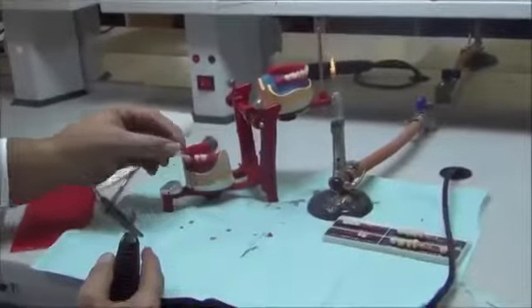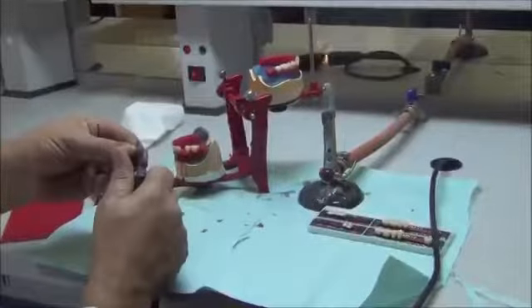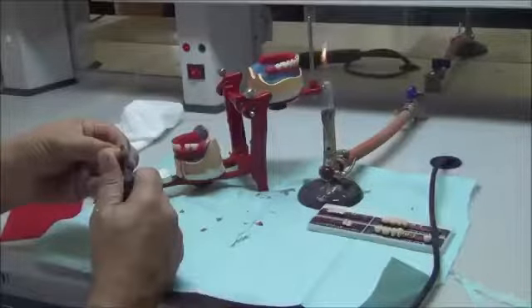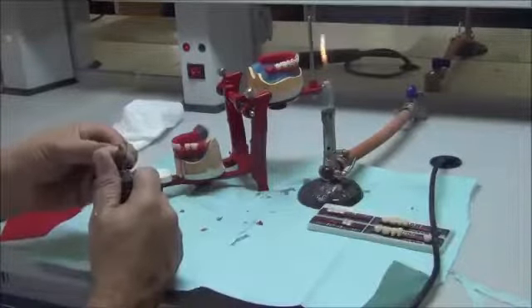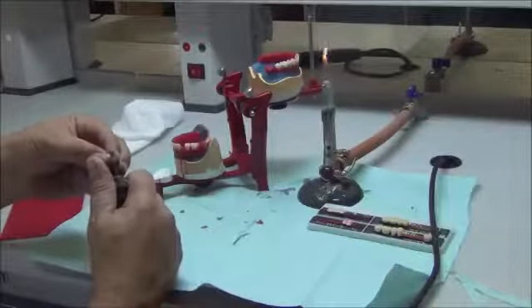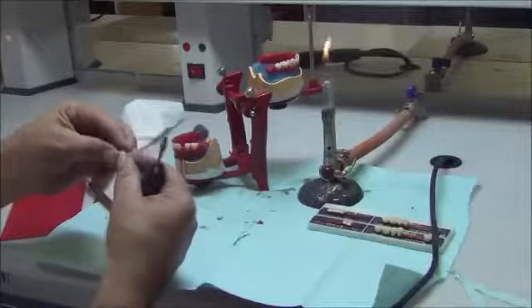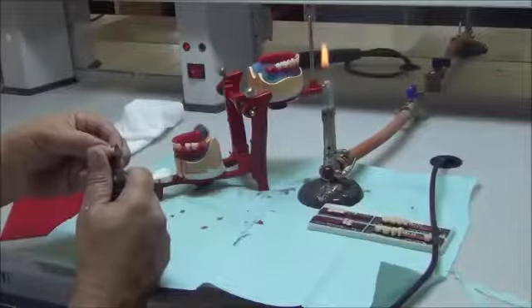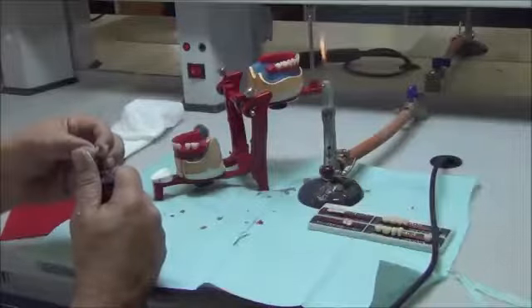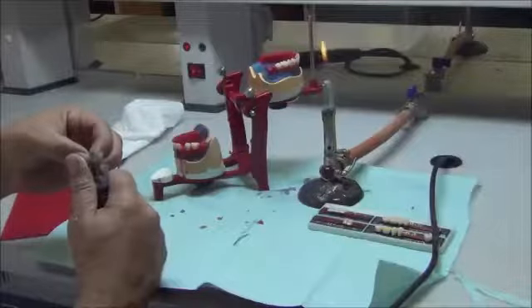So we take out the tooth. Where am I allowed to trim? I begin trimming at the mesial and distal of the tooth. If I find that the morphology of the tooth is going to be ruined and I'm losing a lot of the marginal ridges, I could also remove from the mesial and distal of tooth number 5 if I need. So I begin first at the mesial and distal of tooth number 4 from both sides, while still looking at the occlusal table that the marginal ridge is not reduced significantly. We have more than half of the marginal ridge.